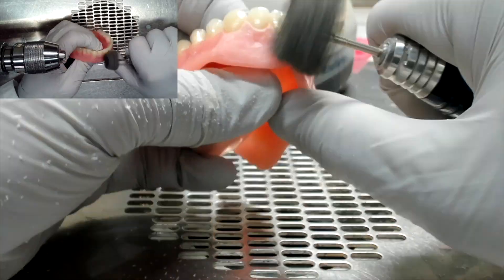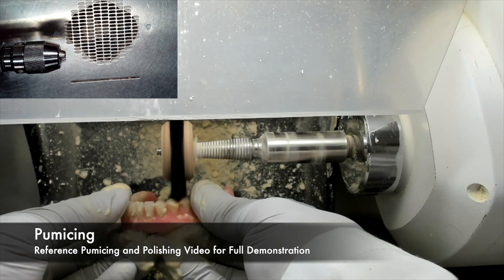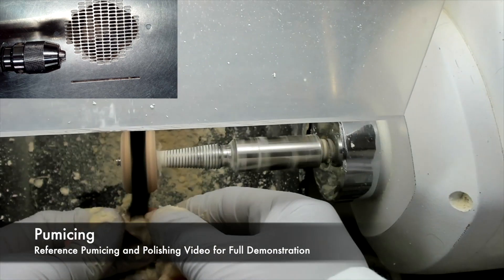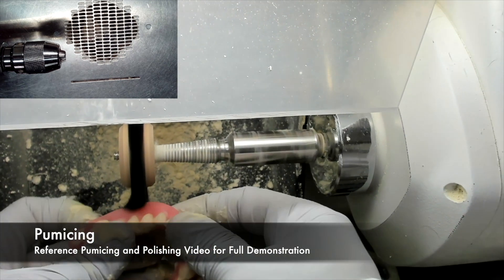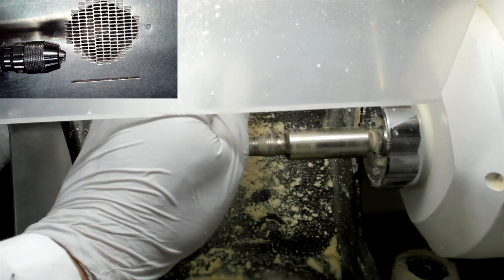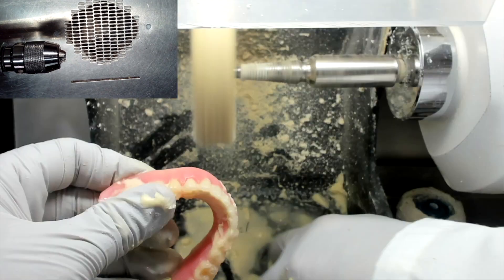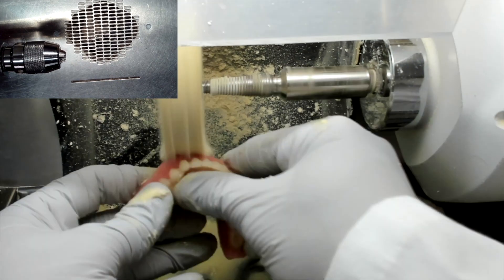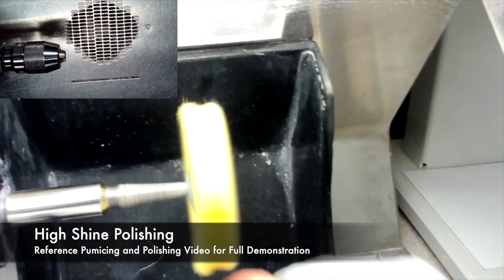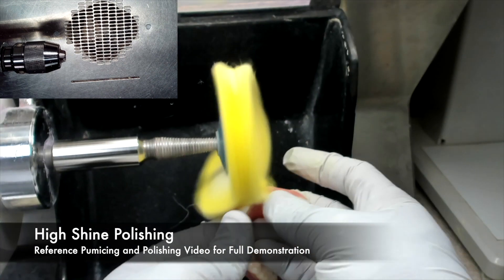Once the finishing and contour of the denture repair is complete, it is now time to pumice. For step-by-step instructions on pumicing, please reference the pumicing and polishing video for a full demonstration. Once pumicing is complete, we can then move to the last stage of high shine polishing. You can again reference the pumicing and polishing video for a full demonstration on these steps.